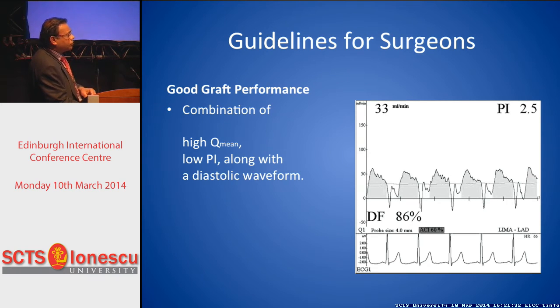If you have a combination of a high mean flow, a low pulsatility index, and a diastolic waveform, as you can see in this particular graph, this is a good graft, and the chances of having post-op ischemic episodes will be very low.